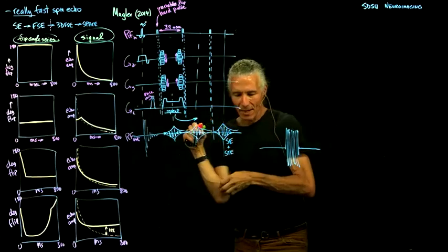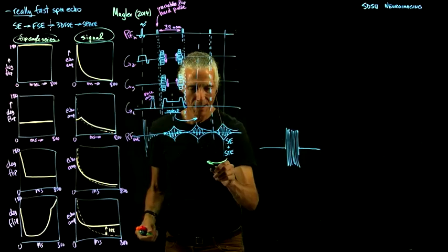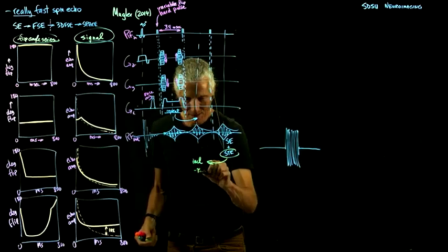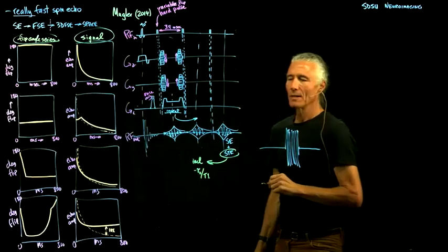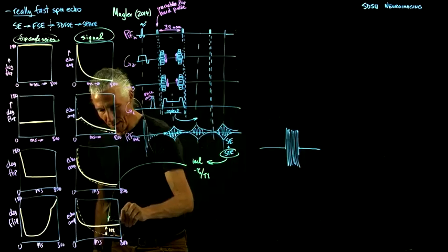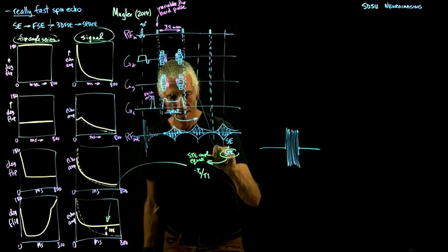And that's good, because if we actually look at the equation for the stimulated echo, it has a term in it that looks like, so this guy includes a term that is minus tau 2, that's the time between the second and the third pulse, divided by T1. And T1 is long compared to T2. So that means it doesn't decay very much. And so, because of that, that's actually what's explaining this part here, why the signal holds up. So this is the STE amplitude equation includes.